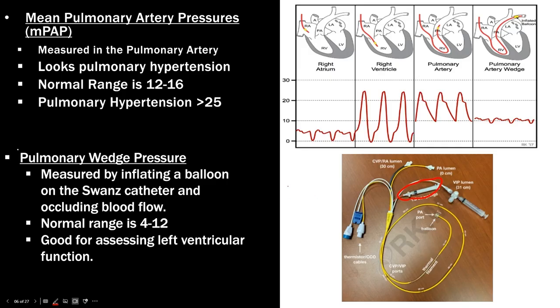The way that it'll look is there'll be two red lines, and then there'll be this horizontal line right here. If the horizontal line is all lined up, it's unlocked and it is able to push air through it. But if the lines are off centered like this, then that means that syringe is locked and you cannot put air into it.